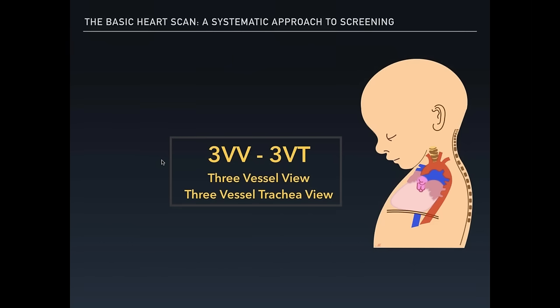Now moving into the three vessel view, three vessel trachea view. So I'm going to just touch up briefly on this, as I know that there is another excellent webinar out there about the three vessel view. So this is just a very helpful view that we use frequently at our lab, and also a very important plane for the great vessels. So if you have not yet started on using the three vessel view and three vessel trachea view, I recommend that you start trying.